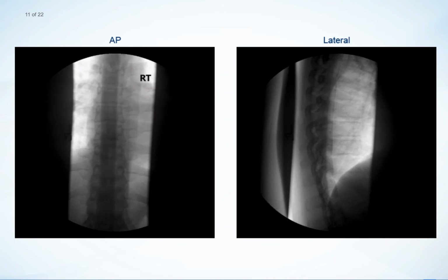After injecting contrast, begin a thoracic myelogram by rolling the patient into a lateral or supine position with the patient's head elevated on a pillow. Slowly tilt the table into a Trendelenburg position while observing the column of contrast moving into the thoracic area. Once the contrast reaches the proper area, return the table to a horizontal position.